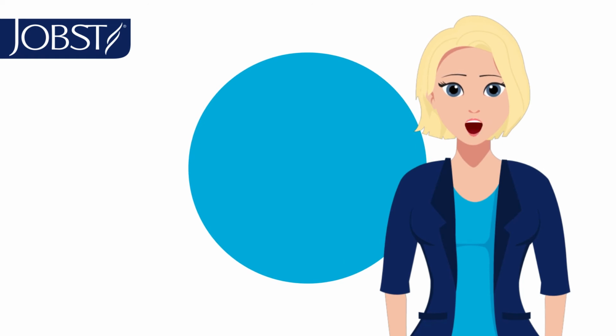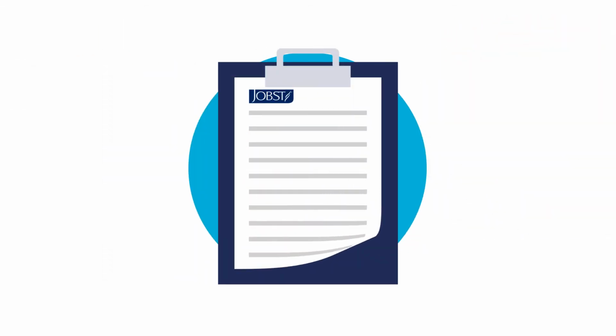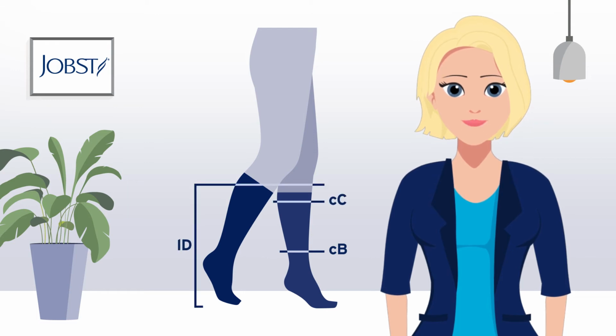Before you start to measure for JOBST ready-to-wear circular knit garments, you will need the following: a measuring tape, a pen, and, if you are a healthcare professional, an order form. In this video, we will show you how to measure for knee-high products. All measurements should be taken without tension. For knee-high products, we need to measure circumference B, C, and length D.